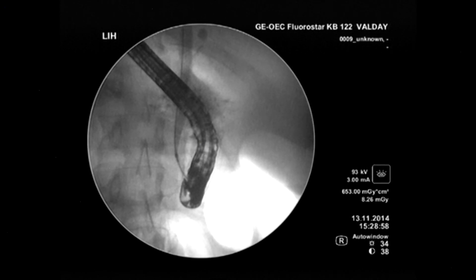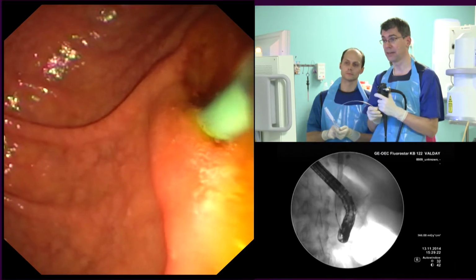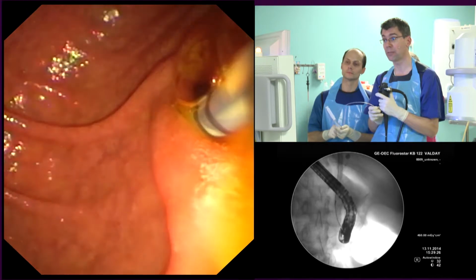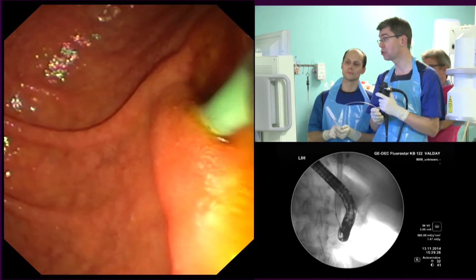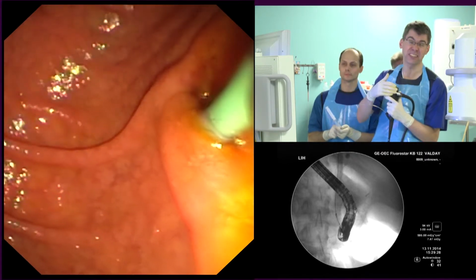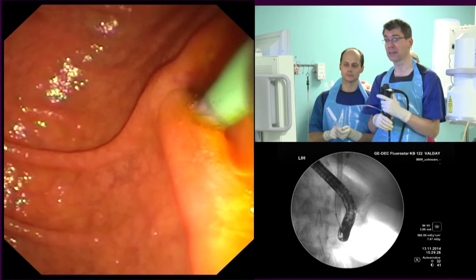So this is the portion of the bile ducts which is giving me most trouble right now, and what I'd like to do is to take samples from here. Because even when we had a very nice cholangoscopic picture, we still need tissue to send to the pathologist to get an idea, is this just inflammation or may there be something else growing inside it.